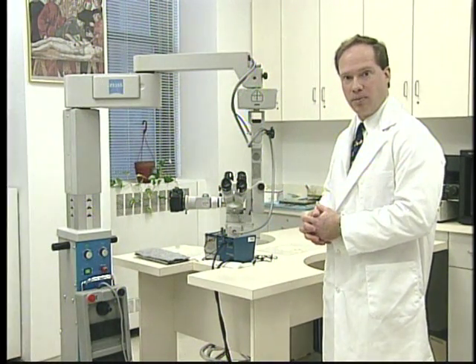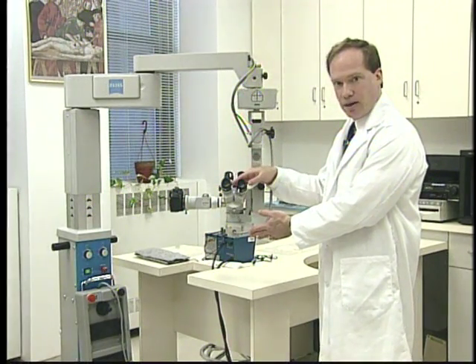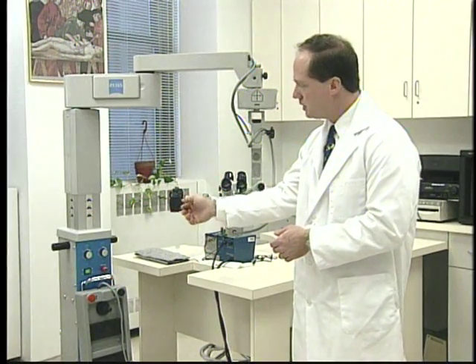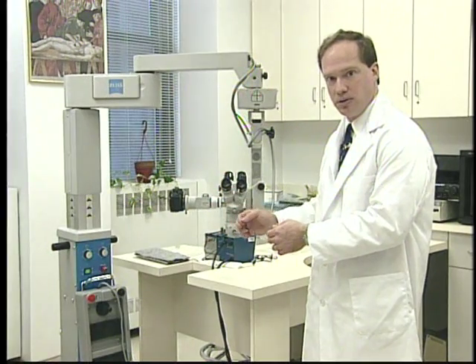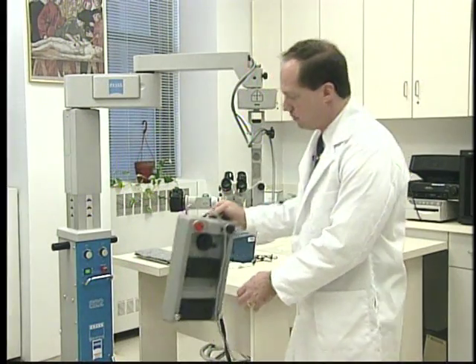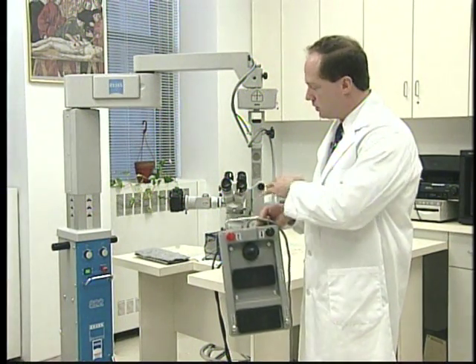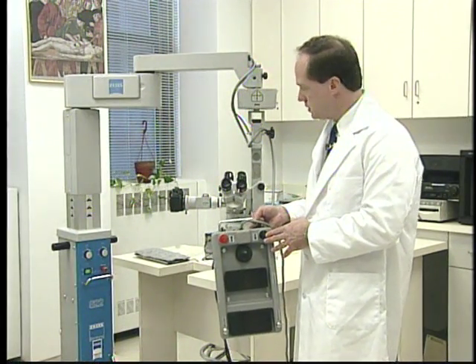The basic parts of the operating microscope, common to all scopes, are this part, the part that you look through. This has the eyepieces and the objective, as well as a cable for the light source. There's a body that controls the intensity of the light source and the up and down motion of the scope, and is a solid piece so that the scope doesn't move and jiggle while you're operating. And there's a foot pedal that's connected to the base usually that controls both the zoom and the focus, and frequently we'll have a little joystick that you can move with your foot to control the XY orientation of the scope to move it in the correct position for fine positioning purposes.